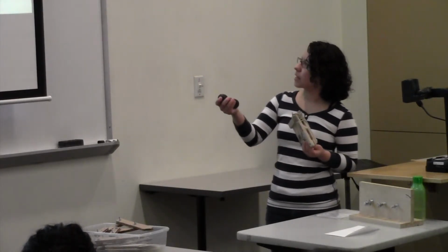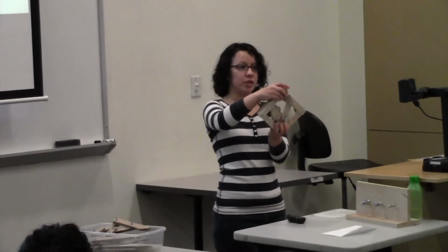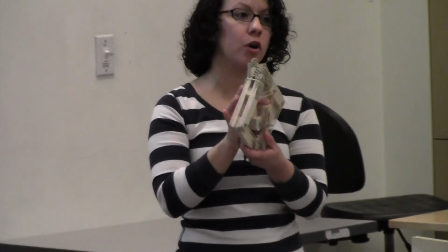And then this right here can only move in one direction. So for this one, we made a track. It can only move in one direction, because if you allow this to move, it won't work symmetrically. So in this piece, you want to build a track or use gears, which I'll talk about a little bit later.